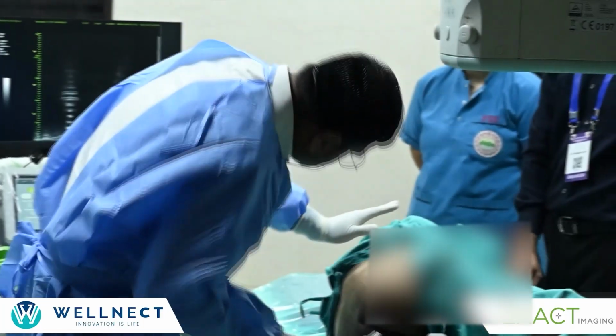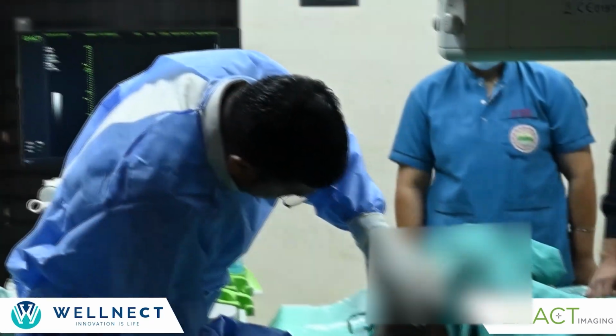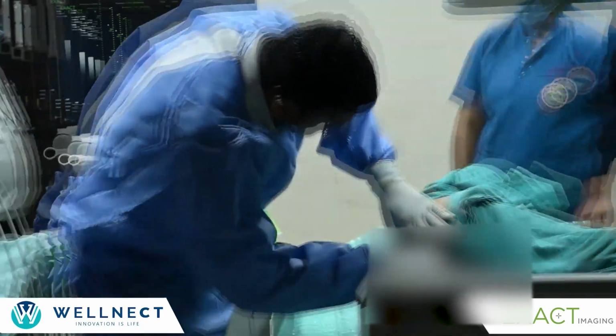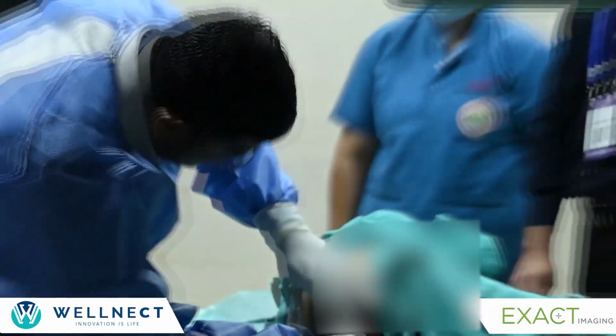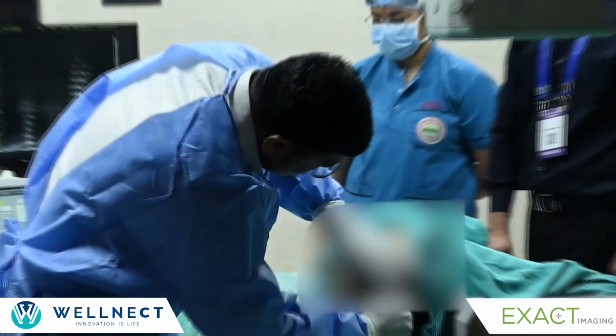Dadaji, we are putting in a medicine and will check. So always tell the patient what you are doing. Breathe slowly, and then you inject lignocaine through the transrectal approach.